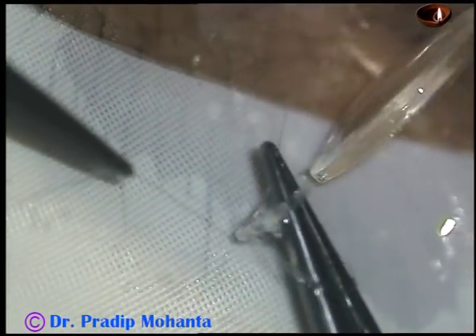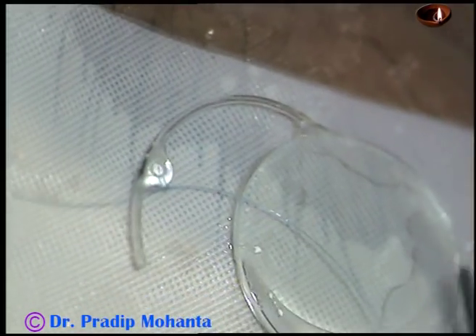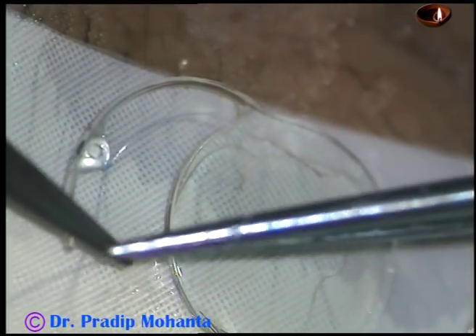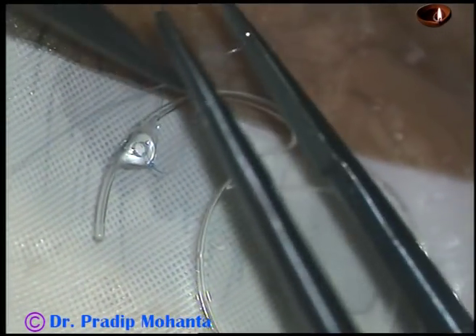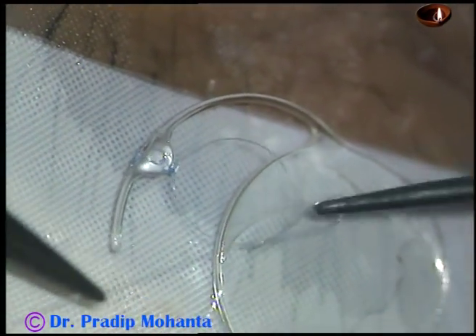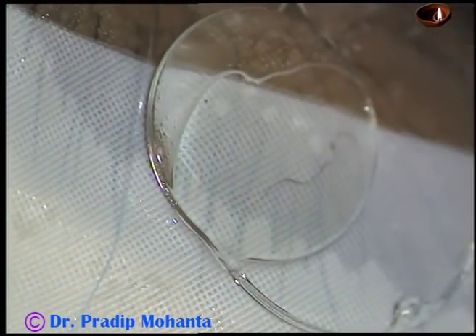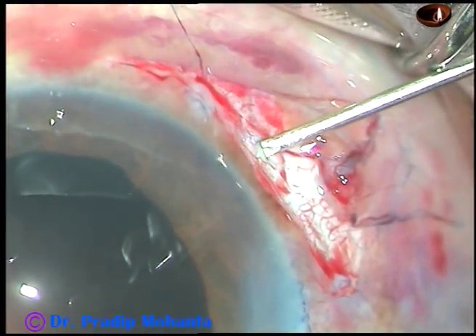This is the intraocular lens from Orulav. This PMMA lens has eyes in its haptics, where a prolene suture can be passed through this eye. The prolene suture is tied by about 5 to 6 knots. Both the haptics are tied similarly when the lens is outside the eye. I am going to place the haptics at 1 o'clock and 7 o'clock meridian.